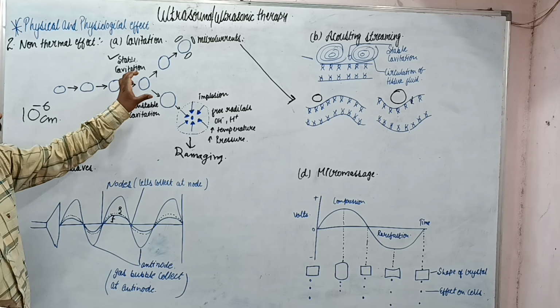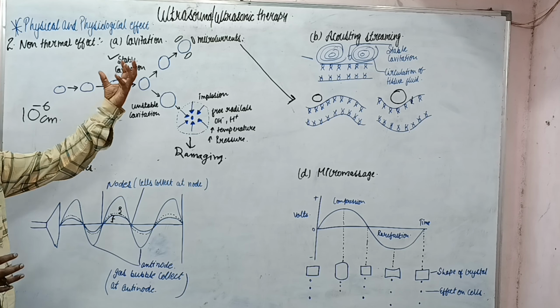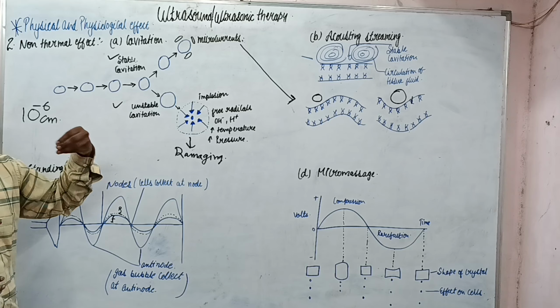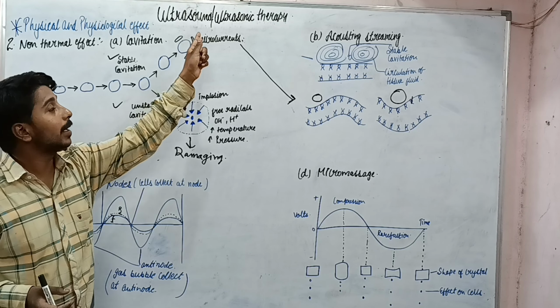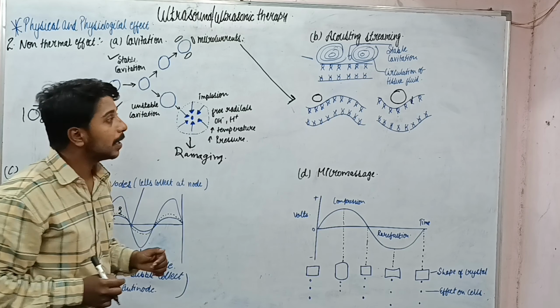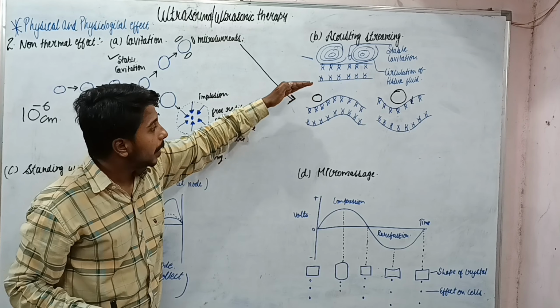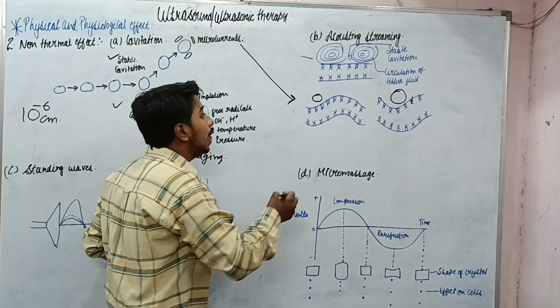But if this bubble is not increasing rapidly in size, but is having a small size, it is very beneficial for us. Why? Because there occur micro currents around it, that is circulation of tissue fluid. Also these bubbles will move to and fro, which will cause the cell membrane to either push and pull. Due to this, the permeability will increase.